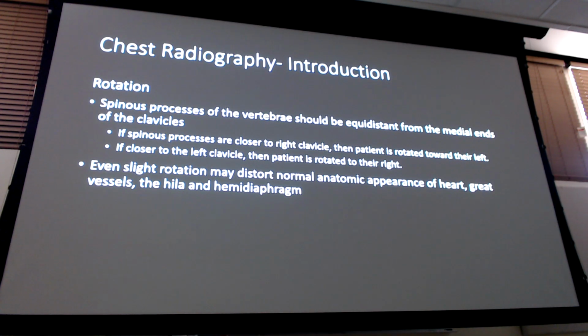That is a condition where everything in the patient's body is flipped, right? So their heart is flipped. Their liver and spleen are flipped. Everything is flipped. No, I am not going to give you a situs inversus patient and try to trick you on the exam. I won't even give you one and tell you it's a situs inversus patient, right? That is so rare. So how would you tell if it was that? Because here's what's going to happen. The radiology people are going to flip your x-ray the way it's supposed to look, even though they have situs inversus.